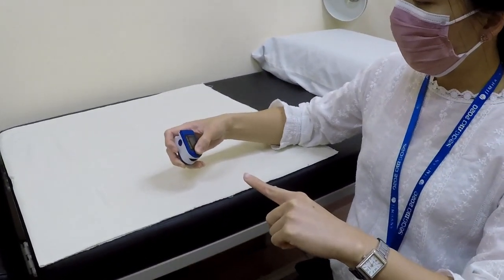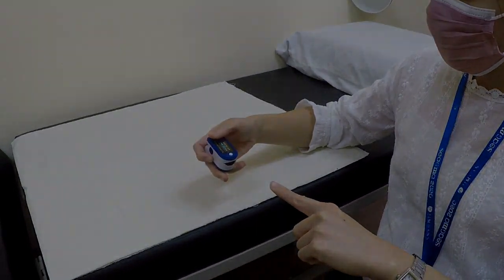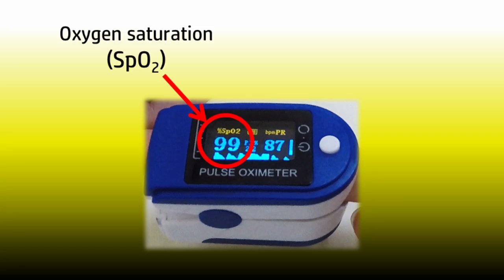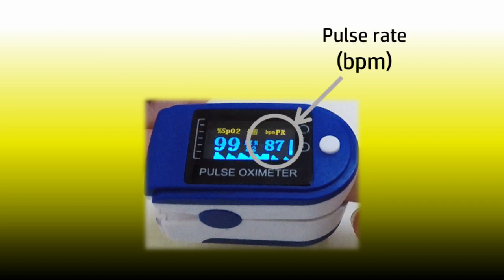Turn on the device by pressing the power button. There are usually two measurements displayed on the device: oxygen saturation, which is marked by the word SpO2 in percentage form, and pulse rate, which indicates heartbeats per minute.